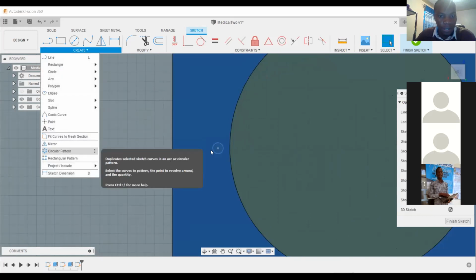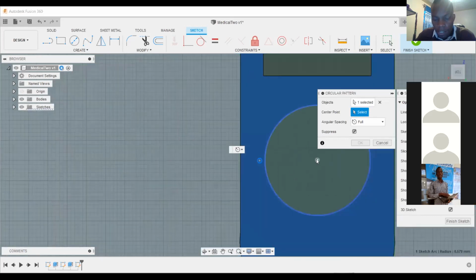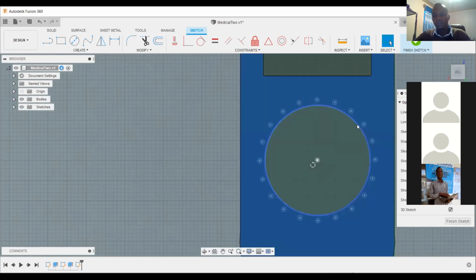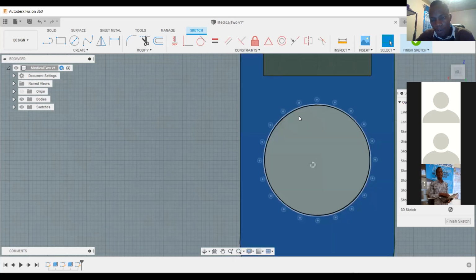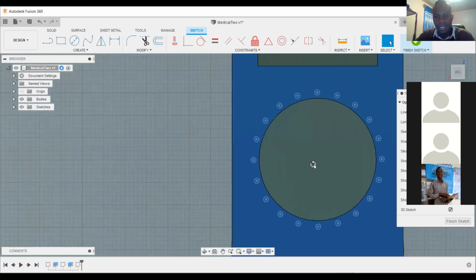And then after you create a circle, you come to create circular pattern. So you click this, then center point is the center of that circle. And then how many you want? Can you do like 10? 10 is a bit small. Do 20. So it's just drawing this circle. You are creating one circle and then you are drawing another one inside it.